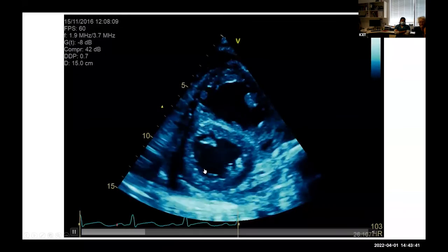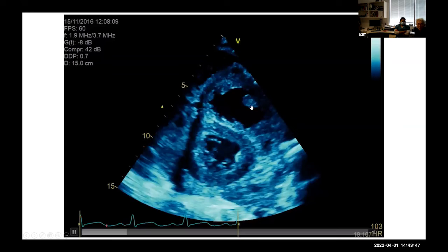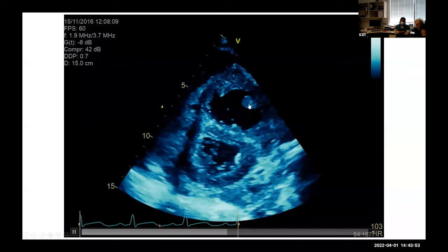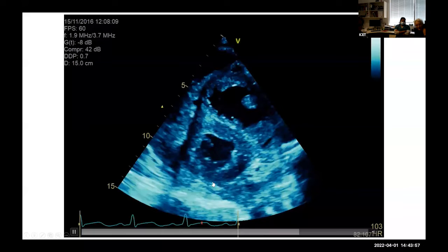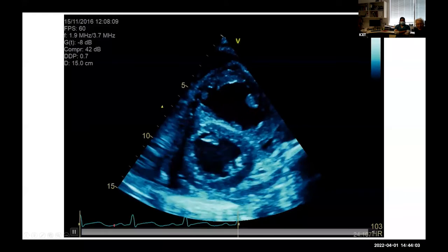I can't see any lesions associated with the mitral valve, because I would be suspicious for infective endocarditis. And I'm less suspicious of this thing up the top here in the right ventricle being an infective nidus on this view, but I need to see more views. Otherwise, I can't appreciate any significant regional wall motion abnormalities. Okay, move on. That was a nice summary.